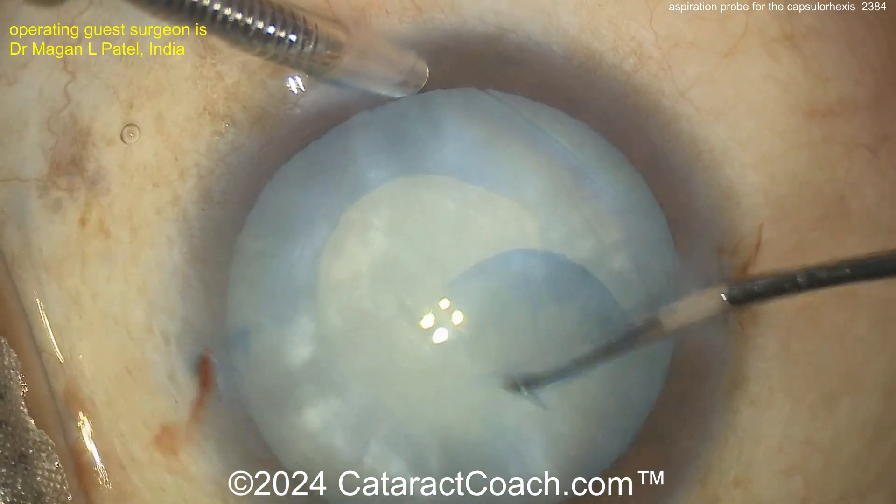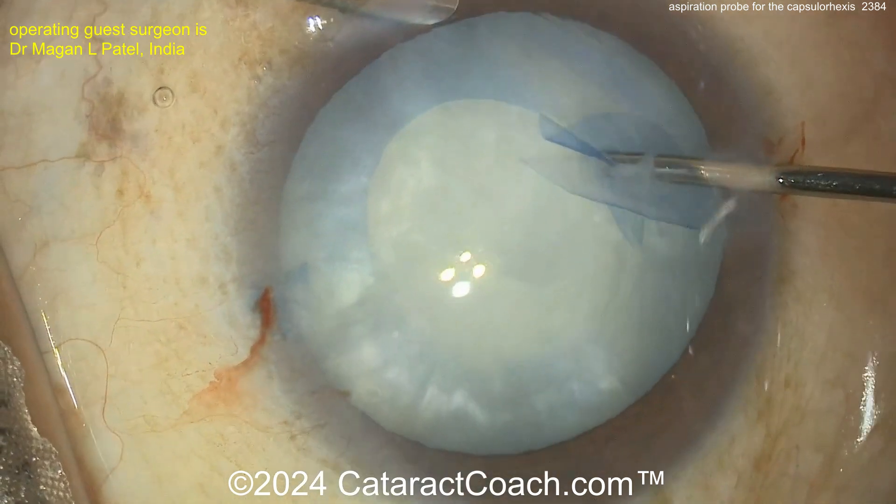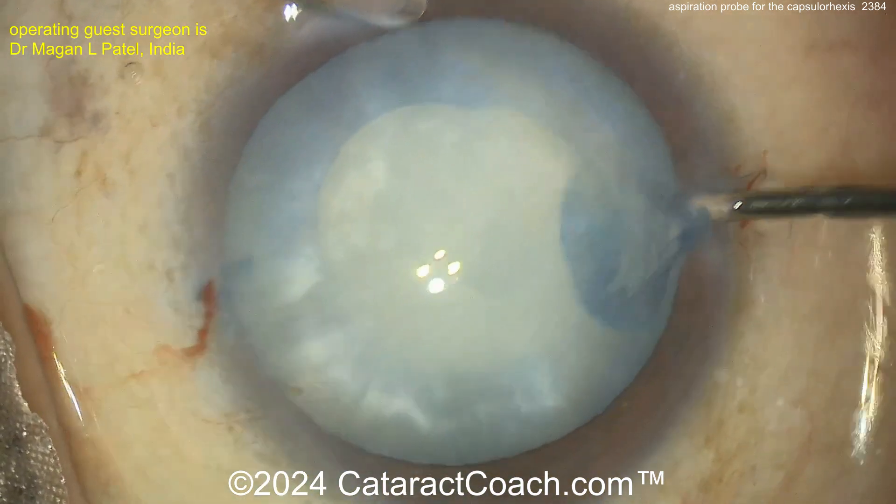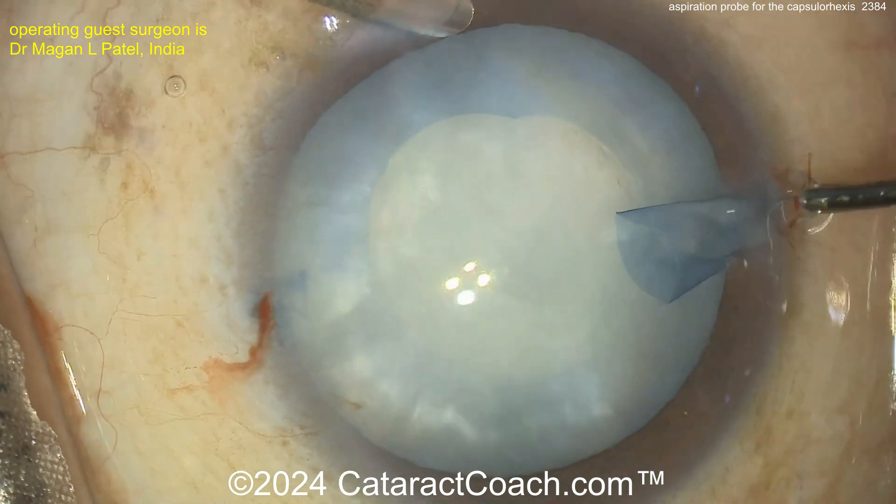And then the last bit — grab onto that and you've finished a beautiful rhexis. I like it. Interesting technique. Not sure I'll end up using this so often, but it's a neat technique.